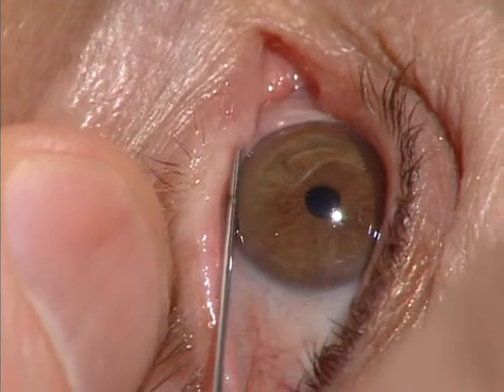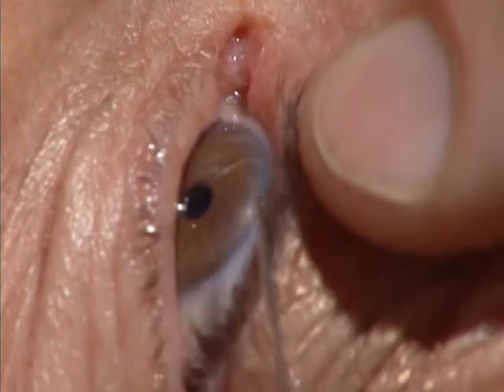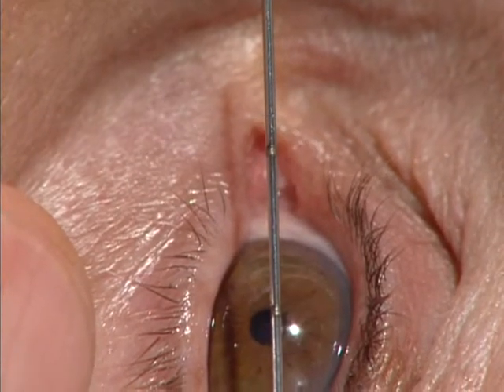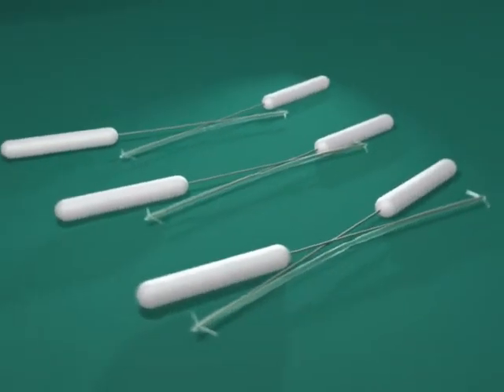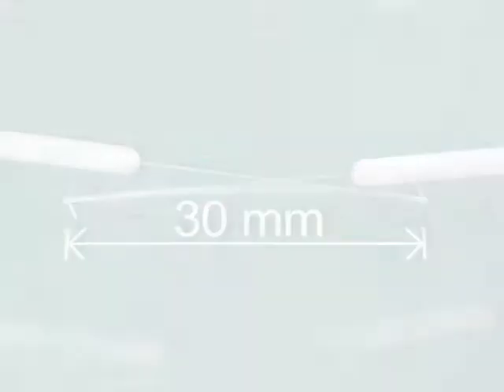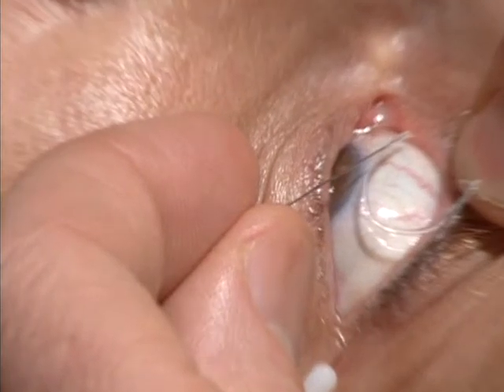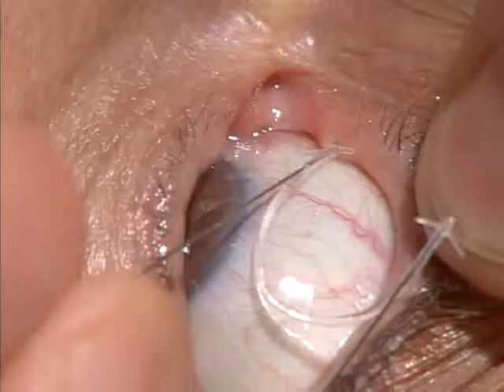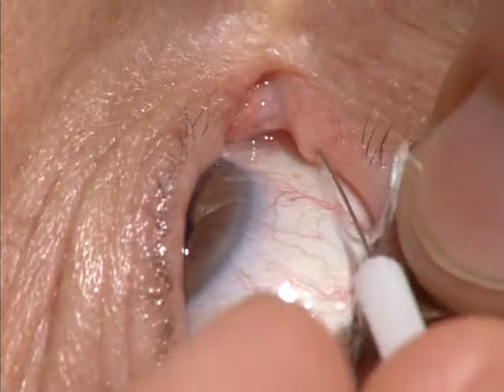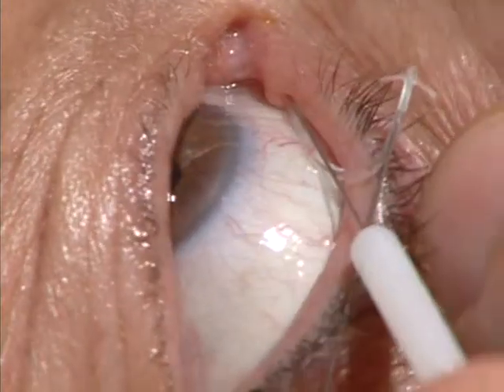Check the permeability of the canaliculi by gently probing to obtain contact with the bone. The 2 marks on the metal probe indicate whether the choice of intubation is correct. We recommend, however, using the 30 mm autostable bicanaliculus intubation set 2 as the intubation set of choice, since it is the most suitable in the majority of cases. Ask the patient to look down as you pull gently on the eyelid. Intubation insertion begins with the superior meatus, inserting beyond the mark to ensure that the winglets have unfolded after passing the junction of the canaliculi and the lacrimal sac.